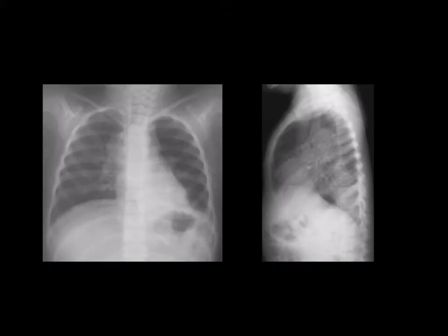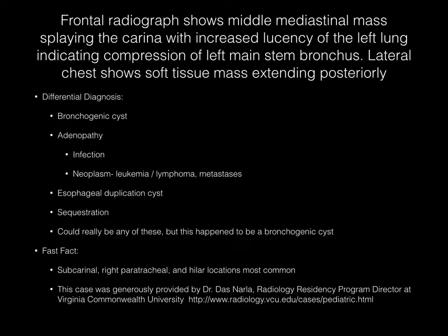Now pause your media player. The frontal radiograph demonstrates a middle mediastinal mass which splays the carina. There is increased lucency of the left lung, which likely relates to air trapping related to compression of the left main bronchus. The lateral chest radiograph demonstrates the soft tissue mass extending posteriorly. Your differential diagnosis should include bronchogenic cyst, adenopathy related to infection and neoplasm, esophageal duplication cyst, and sequestration.